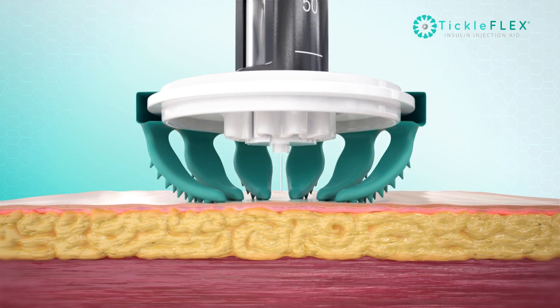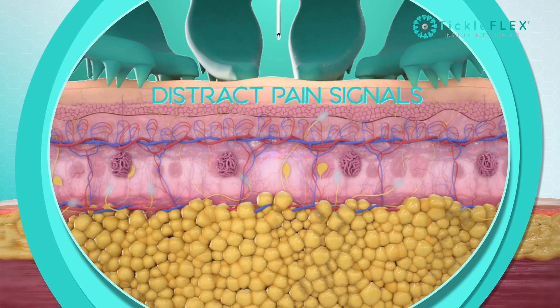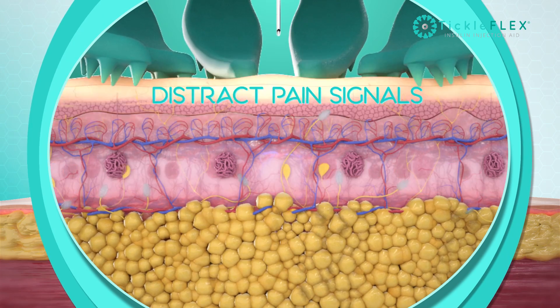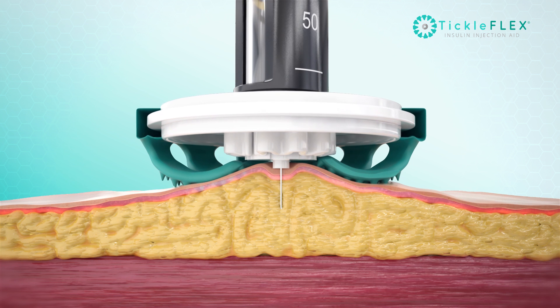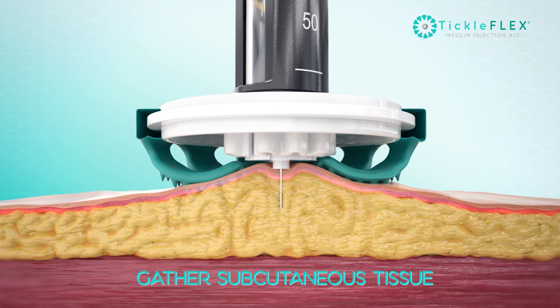The highly textured fingers tickle the skin, distracting the nerves to mask any pain and also conceal the needle while injecting. As the needle enters, the fingers gently gather a small fold of subcutaneous tissue, helping to direct the insulin to where it is intended.